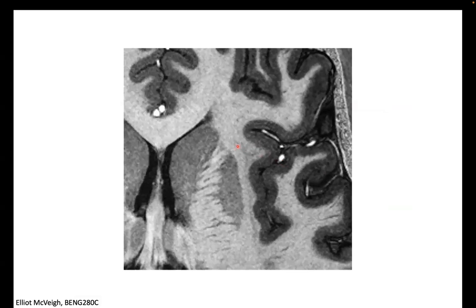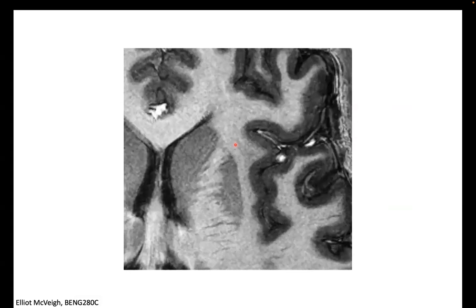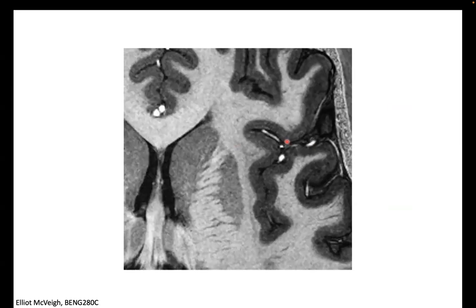When the brain is pulsing, if you don't cardiac gate, for instance, then these tiny little vessels here and there, and the structures, will be in slightly different configurations because of the very small displacement caused by the blood pressure that comes into your brain every systole, right?